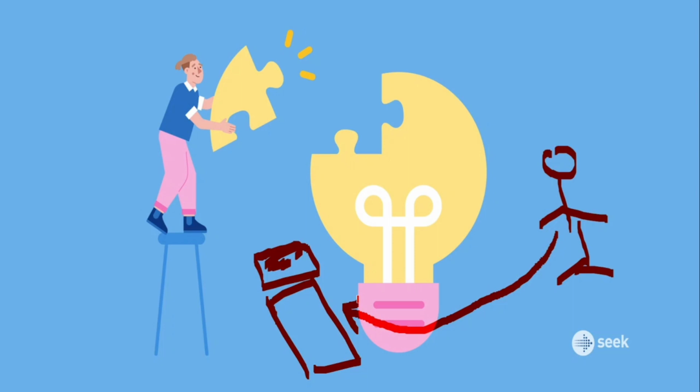For that we have to prick the artery. But if we prick the artery, once or twice is fine, but over a period of time the artery will be damaged. We can't cannulate it multiple times. What else to do? We can cannulate the vein and try to take the blood from the vein as we do for sampling, but that won't work because venous blood won't come at a particular force. It will be stagnant. Yes, you put a suction pressure, blood will come, but if the suction pressure is not there, the blood won't come.